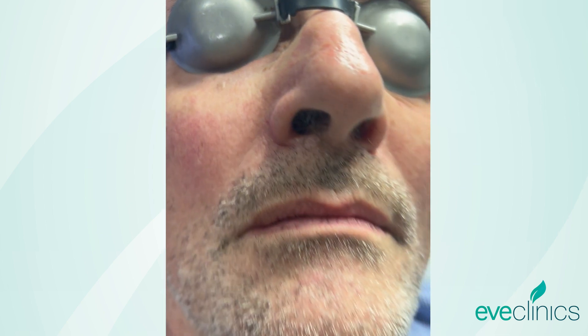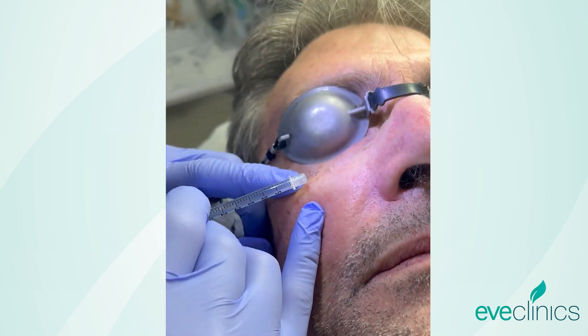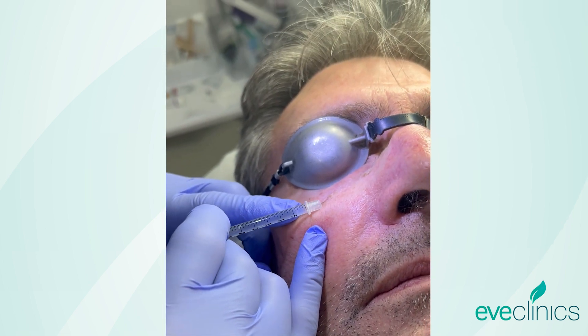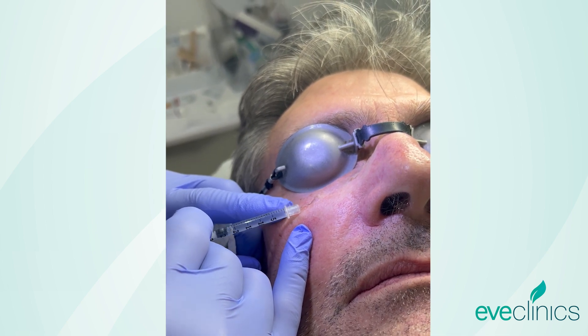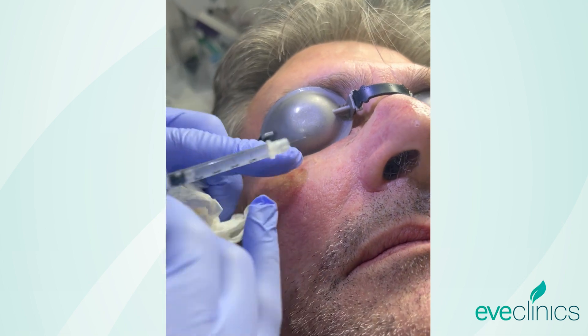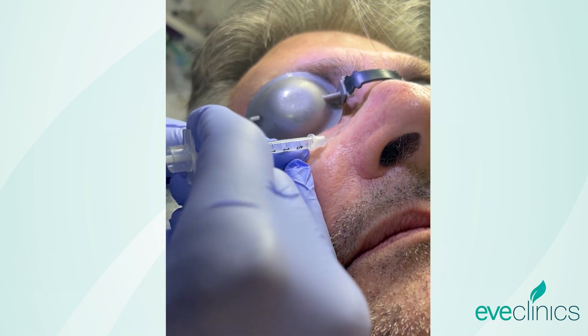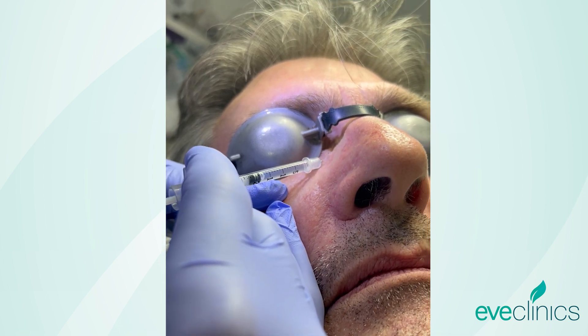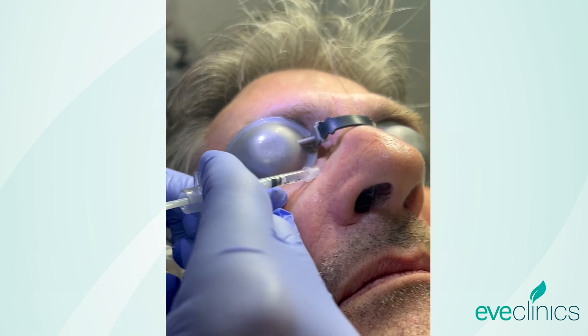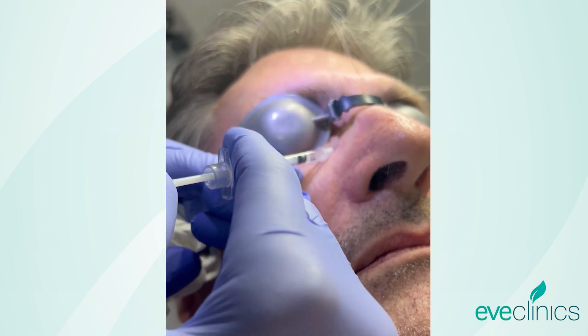So first we start by infiltrating a little bit of local anesthetic — just a little sting here. What this does is it just lifts our cyst up a little bit, gives us a bit of a plane to work with, whilst also making the procedure a lot more comfortable for the client.